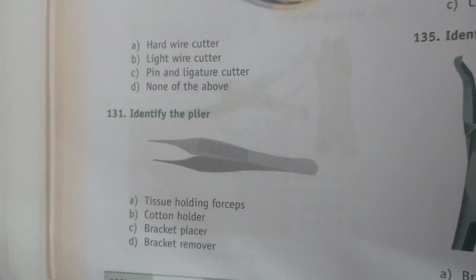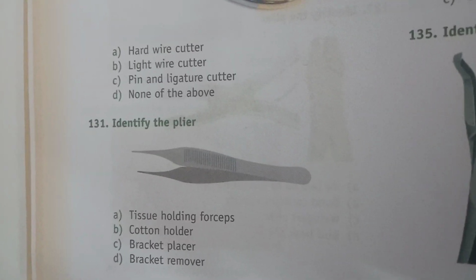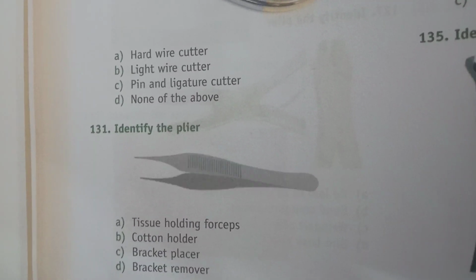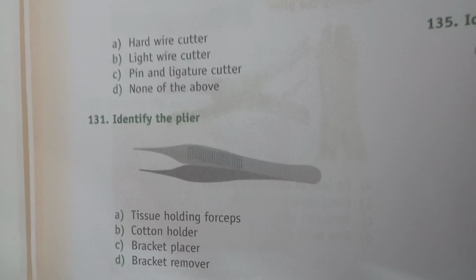Next, identify the plier. This is tissue holding forceps.